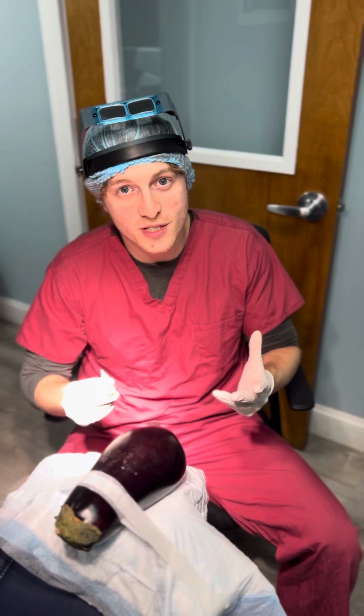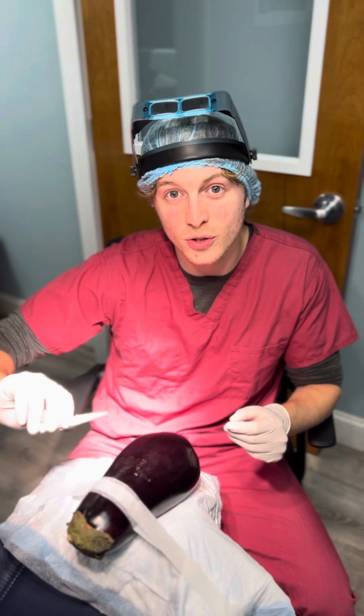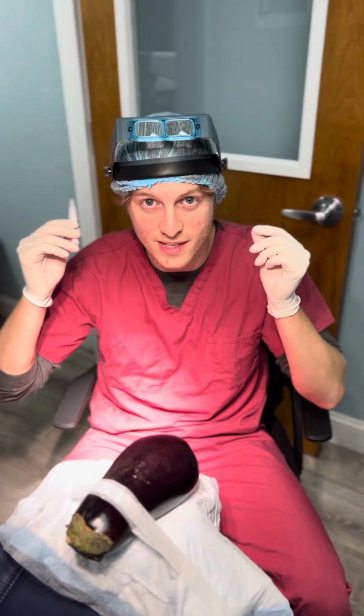We've got no surgery, so we thought we would test out a few new products sent over to us. Those products are for making incisions. Incisions are the cuts that we make to insert grafts into once we've taken the grafts from the back and sides of the head.